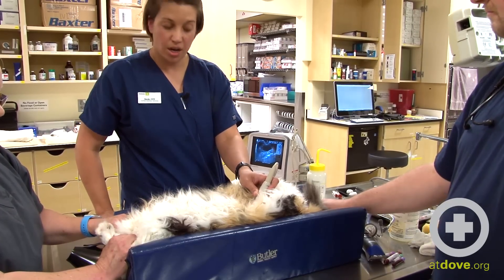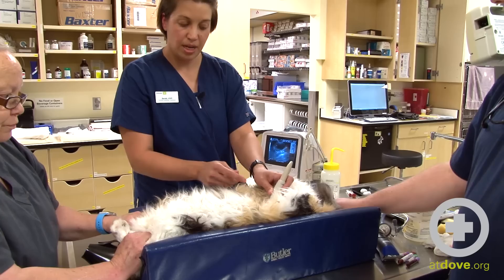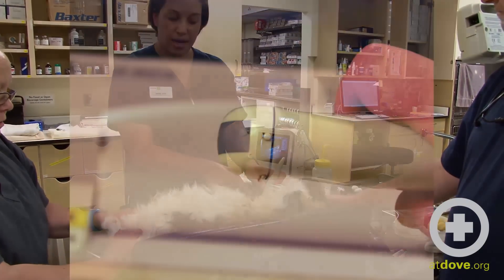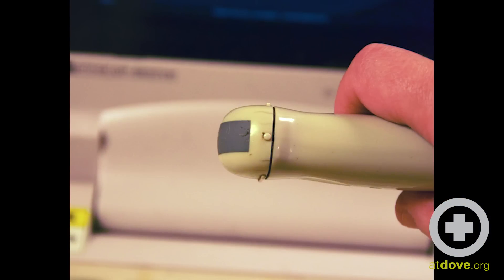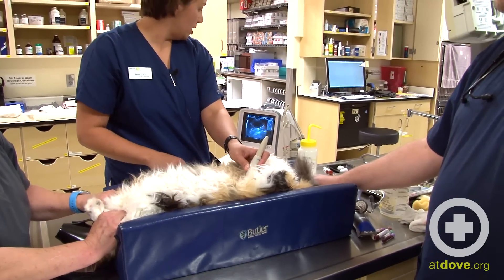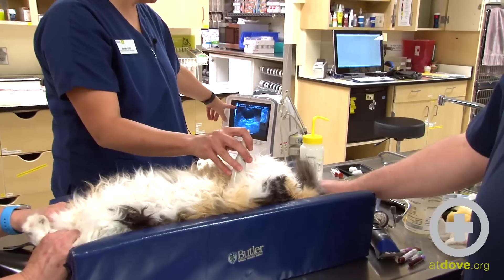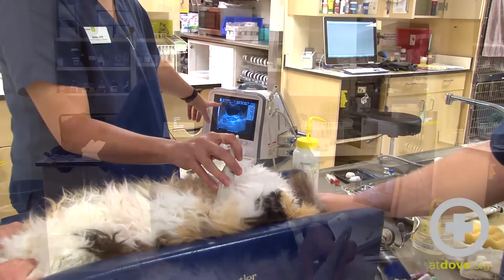We have Morgan here in dorsal recumbency and I have the probe on the caudal portion of her abdomen. There's a small dot on the front part of the probe, and on the screen that's going to show the cranial aspect. On my screen, the dot is represented by that arrow.